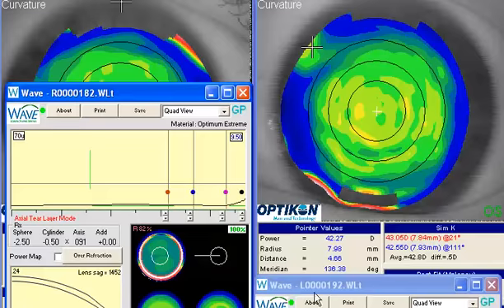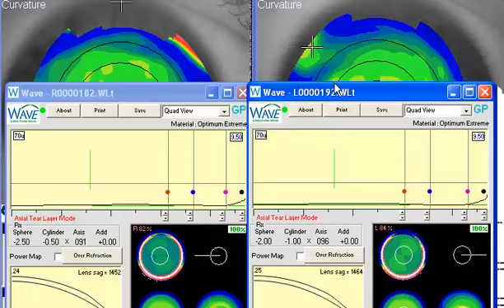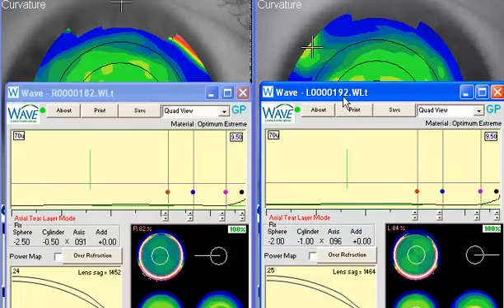The same thing if we look at your left eye, and your left eye has a little more cylinder to work with. You have about a half diopter of corneal cylinder. The refraction, if I believe, is about a diopter, so you have a little bit of probably lenticular cylinder to deal with. But if we look right here again, you've got a really nicely aligned lens in this G-Sim design, and it seems like it would be very straightforward. But once again, my guess is that Wave is creating, based on the G-Sim, sort of a bitoric design, if you will, or a back surface design is what I should say, back surface toric, and the cornea is not toric enough to hold that position, and you're probably getting some oblique cross cylinders when you're over-refracting the patient. So what can we do to kind of fix that?